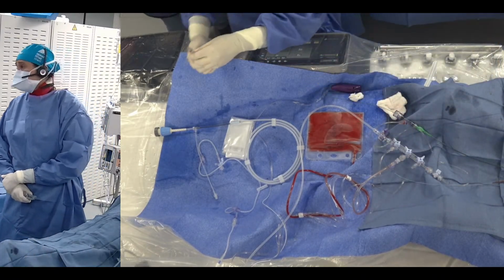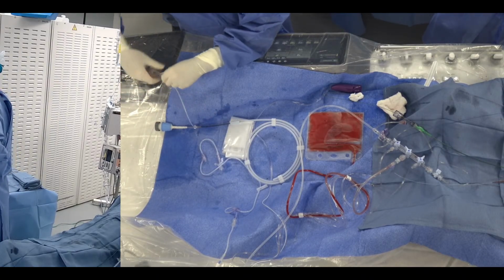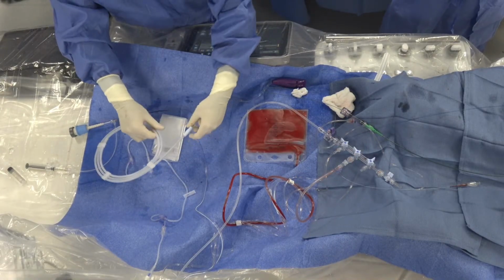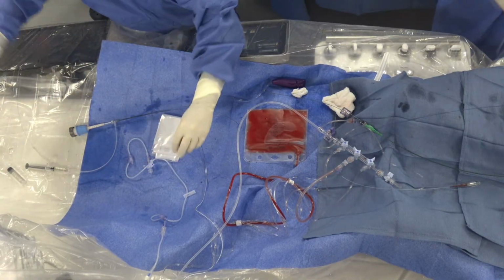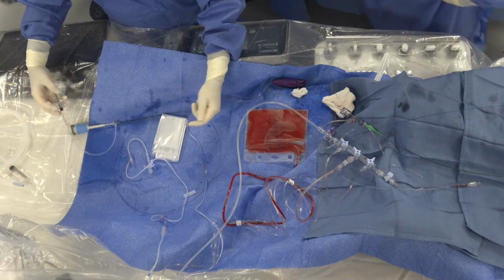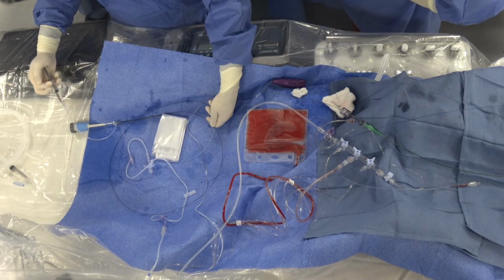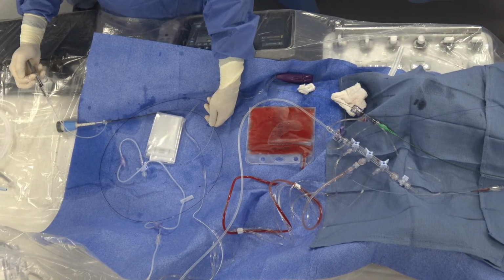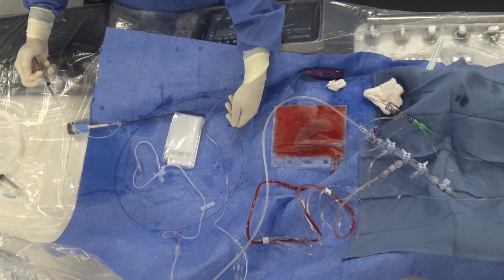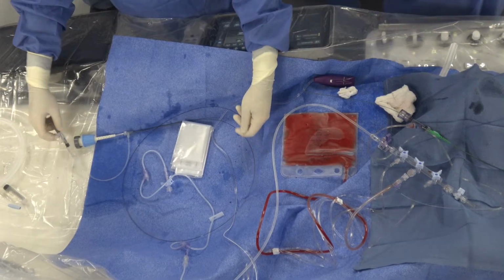Can you tell us why is it that we need 100% contrast? Yeah, because this is the Abbott recommendation. It has higher viscosity and fewer air artifacts. So they recommend to use the 100% pure contrast, so that you are able to see everything well. One thing about OCT is that you only need dye. Blood has to be replaced. So that is why the recommendation is 100% contrast, and this contrast goes into the tube there.